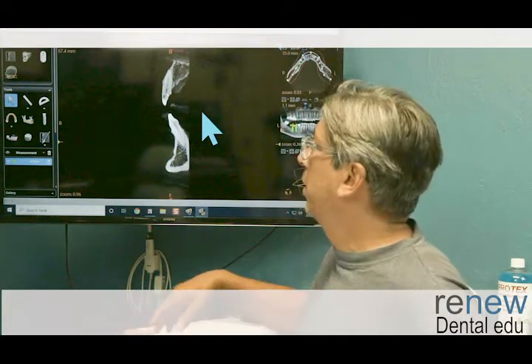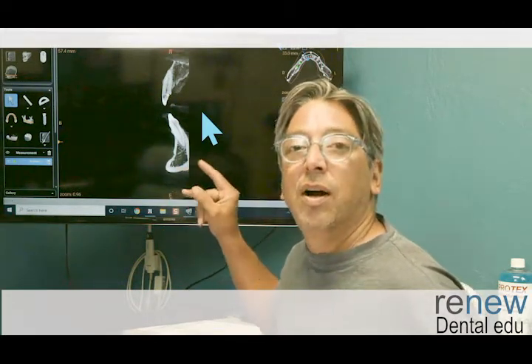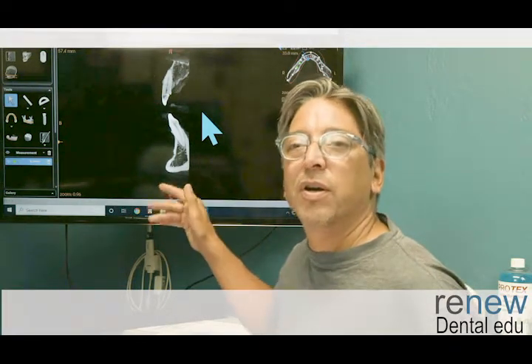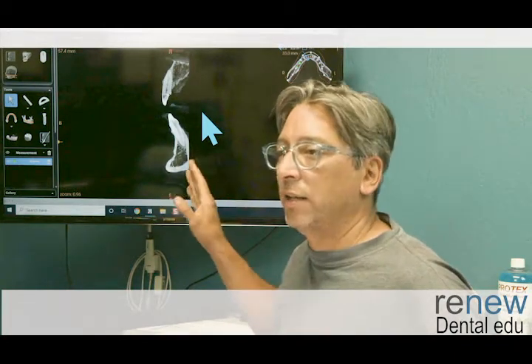Nothing, no miracles here. So if you are a starter dentist and you're looking for a case, this is an example of that for a single tooth replacement, for a straightforward, easy surgery, limit the drill, but otherwise this should be very successful.